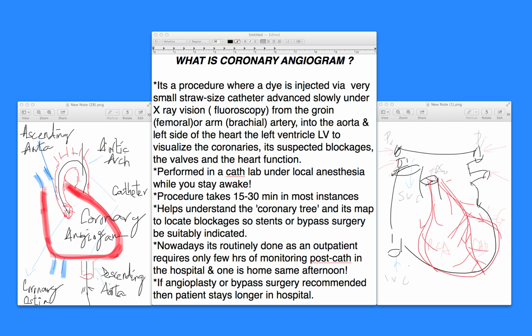So in a nutshell, I would consider a coronary angiogram a minor procedure done under local anesthesia as an outpatient, where a catheter is advanced, a dye is injected, and the coronaries are visualized. It's an absolutely safe technique. Again, small minor complications are always there, and those are listed elsewhere in various textbooks and journals. You can refer to them, or to various other websites. But my recommendation is that it is a very, very safe procedure in good hands, and obviously done at good reputable medical centers.